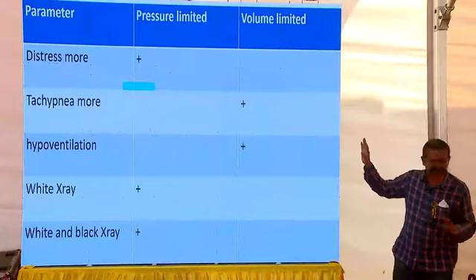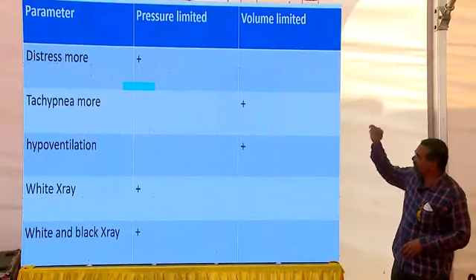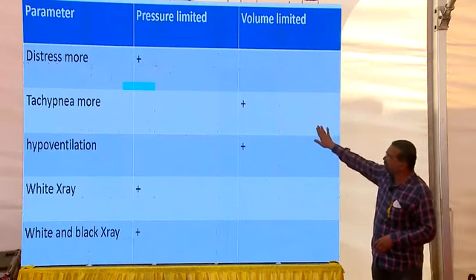So this will try to make it actually objective. This is actually the take-home message. This is the end of the talk actually. Distress more, prefer pressure limited. Tachypnea more, prefer volume limited.